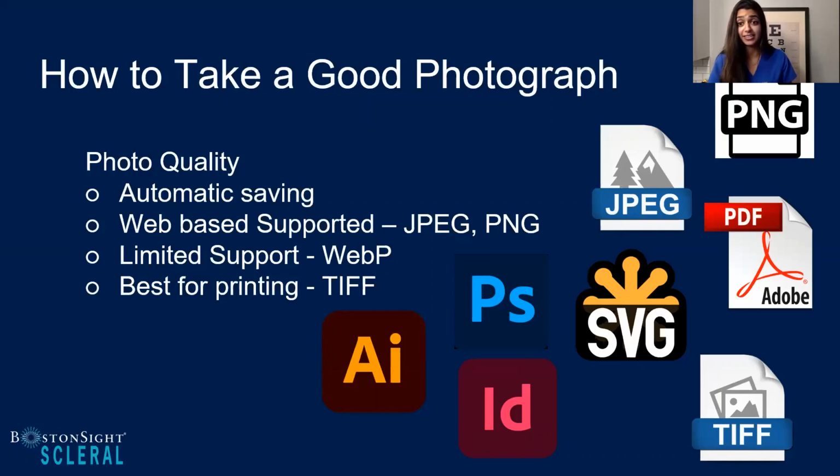And we know that in the day of technology, and I am not a computer scientist by profession, there are so many different options on how to save an image. The one take-home point from my own practice is that I would take a beautiful image, and when I saved it, oftentimes, depending on the size of my image, if it compressed the size rather than the actual image size, I'd lose a lot of clarity where the images would get pixelated. I'd lose some details or the sharpness. So when you can, keep your original image size, because that detail is crucial.